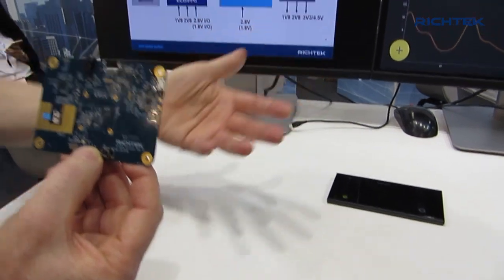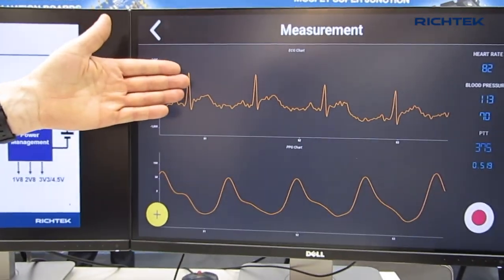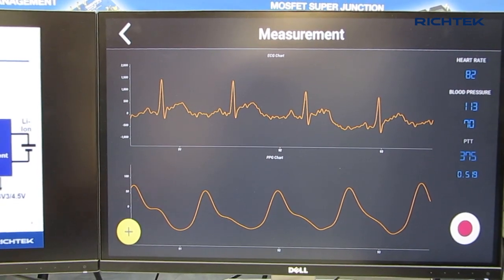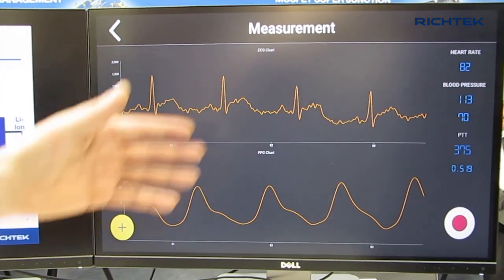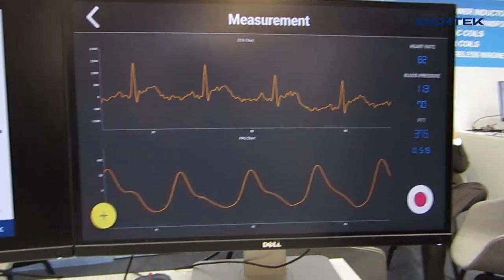The mobile phone receives the raw data, does the manipulation of the data, and can extract the two waveforms. The top waveform is the ECG waveform and the bottom waveform is the PPG waveform, the measurement from your vein pulsing blood circulation. Finally, after this measurement you can get your heart rate and measure your blood pressure.